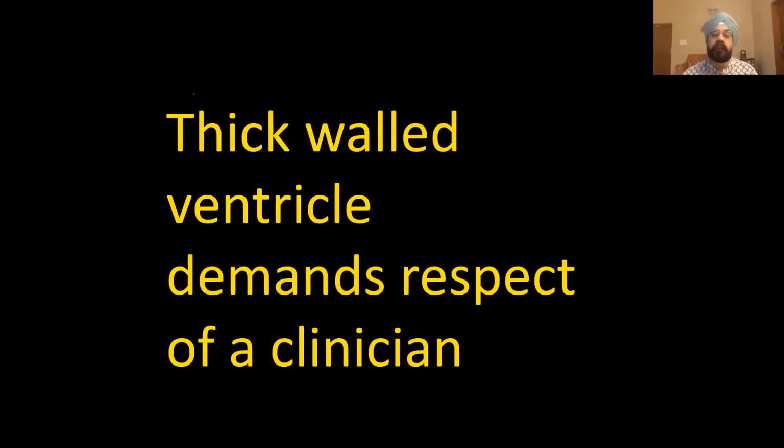Okay, so how do we differentiate that? I think you've already answered non-compaction and apical HCM. People are still interested to know about Fabry's disease. Dr. Sanjeev Bhatt wants to know, how do we suspect Fabry's once we see a left ventricular hypertrophy?